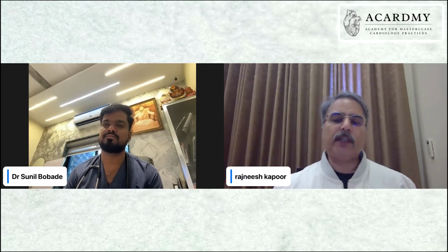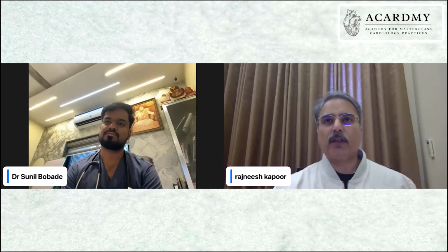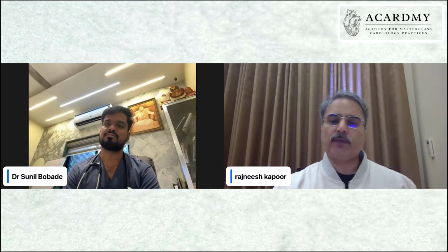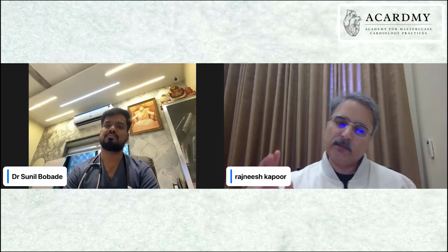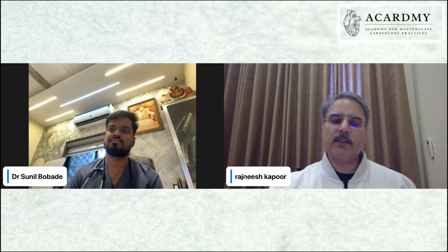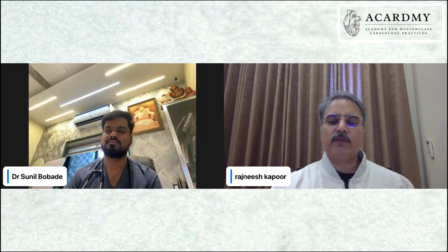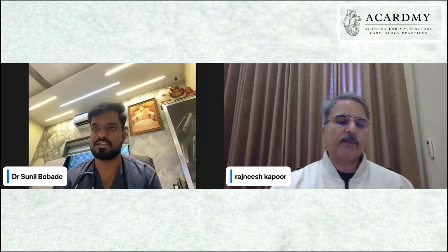Now, once you have attempted the RCA, you are much safer. You have already revascularized the RCA. The reserves would be much better and you will be much safer. This is the way. And suppose you do not open the RCA, again push the patient for surgery. Suppose you fail, once again counsel the patient for surgery. If they're still okay and understand that doing the left system will be partial revascularization, then get it written on the file and you can attempt it. But it's risky to deal with the left system while you haven't done the RCA. Okay. Thank you. Thank you.